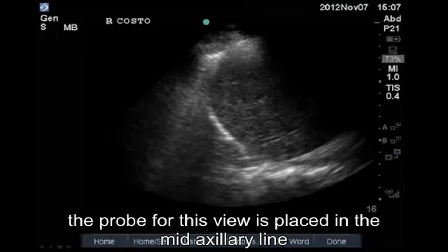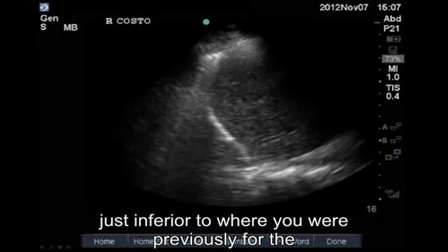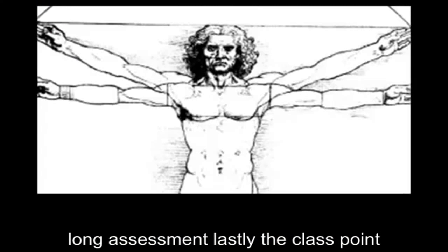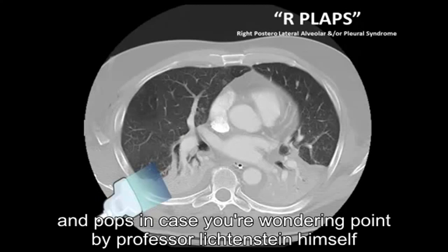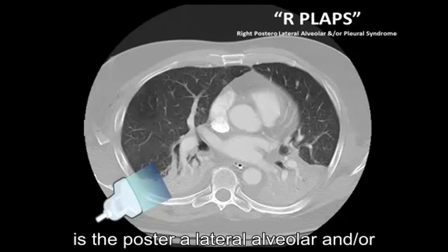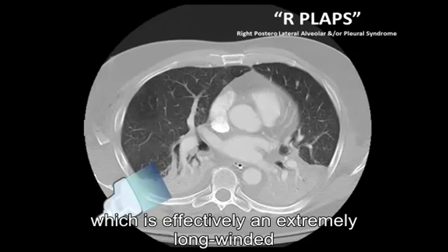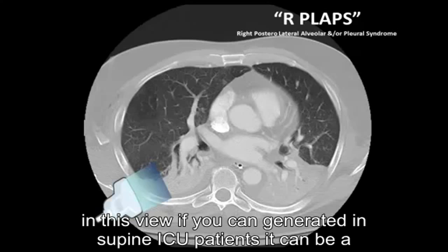The probe for this view is placed in the mid-axillary line, just inferior to where you were previously for the lung assessment. Lastly, the PLAPS point. And PLAPS, in case you're wondering, coined by Professor Lichtenstein himself, is the posterolateral alveolar and/or pleural syndrome location, which is effectively an extremely long-winded way of saying you're going to find lots of stuff in this view if you can generate it.